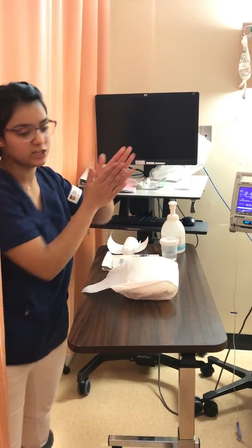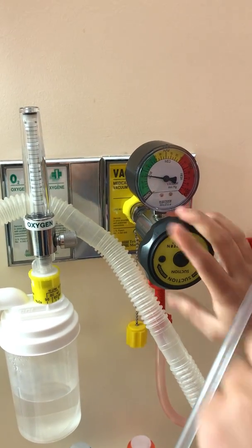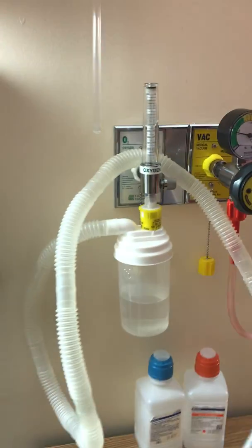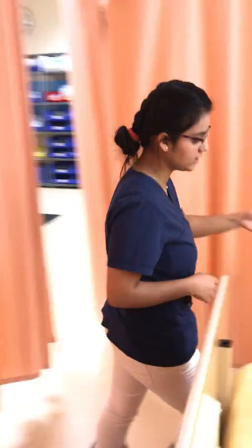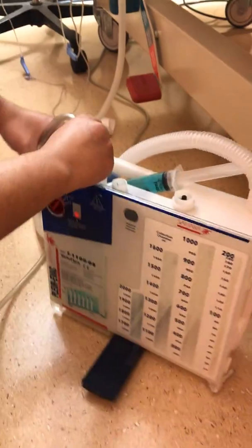I'm going to do hand hygiene. I'm going to go around and check my suction. My suction is on, and I can also see that it is at low continuous setting. Anywhere in the green is low continuous setting, which it is. I'm going to follow my tubing around and watch out for any kinks or bends that would prevent the drainage. I can see that it's connected here, so my suction is connected.